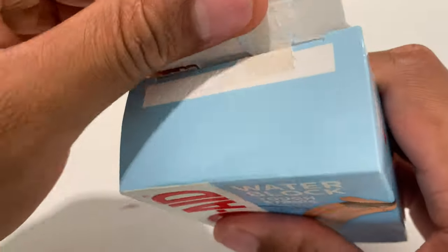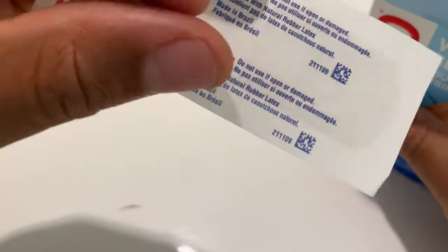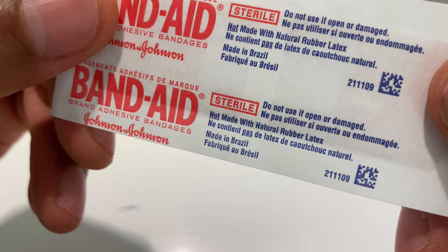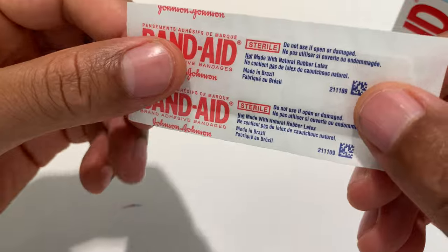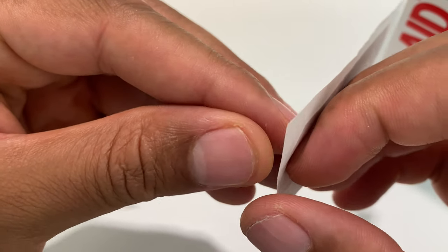Opening from the top — inside are a bunch of waterproof bandages. I'm going to grab one. Here is the bandage right here. It says do not use if open or damaged, and it doesn't look like it's open or damaged, so let's see what this looks like.